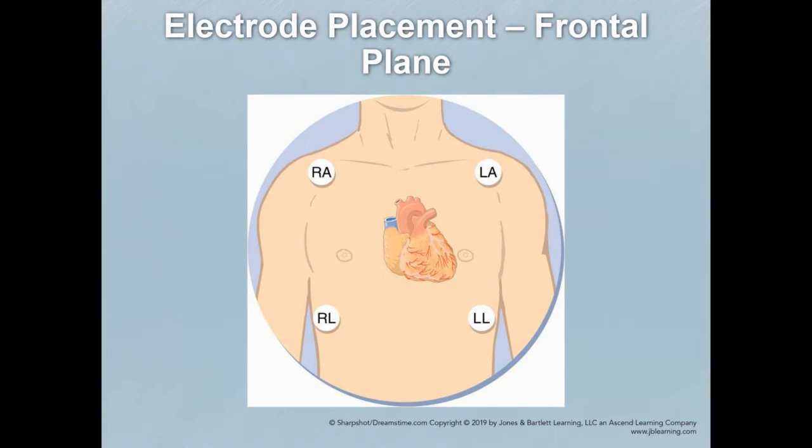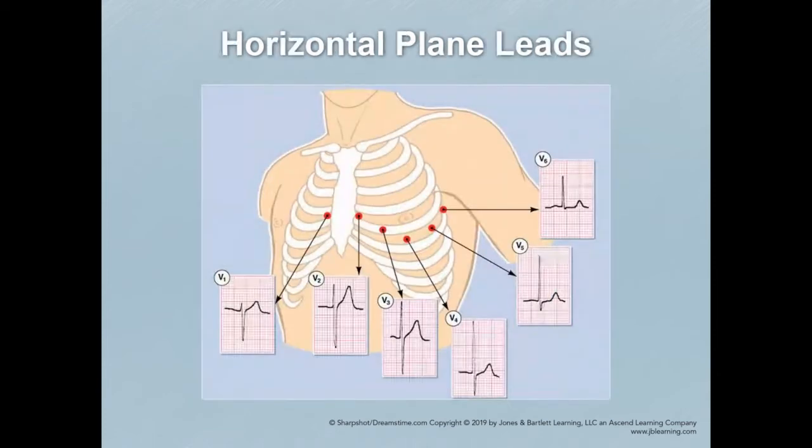However, in the pre-hospital setting, we may need to dial that in a little bit, bring it to the shoulder or the upper chest, bring it to the upper thigh or lower torso in order to remove joints from our tracing. When I say joints, I mean physically our wrist, elbow, shoulder joint, that type of thing, because of vibrations that may be all around us from just simply the truck running or anything like that. So you might see a lot of pre-hospital situations where those leads are placed a little tighter.